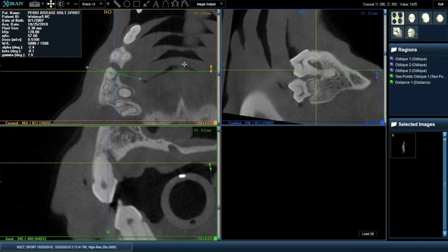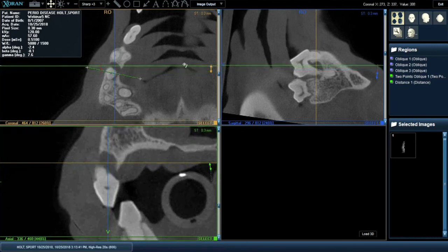On the human side, as a periodontist, I can tell you that the classification we use, class 1, 2, and 3 furcation involvement, is really a clinical measurement. We use the Nabers probe. Someone just a few days ago was asking me, what do you use? We use a Nabers probe to measure furcation. This is a curved, angled probe specific for furcation measurements.